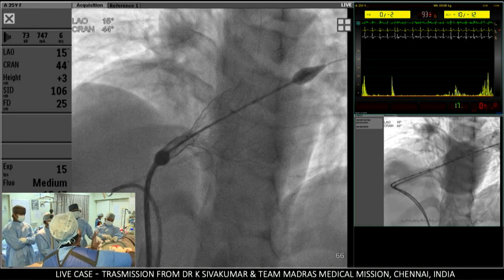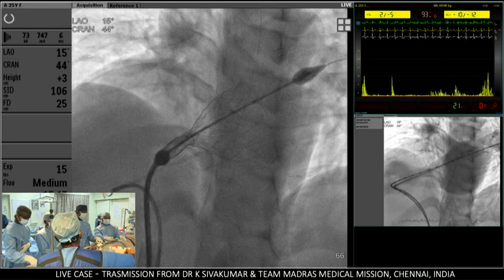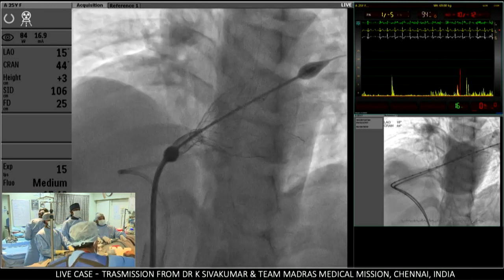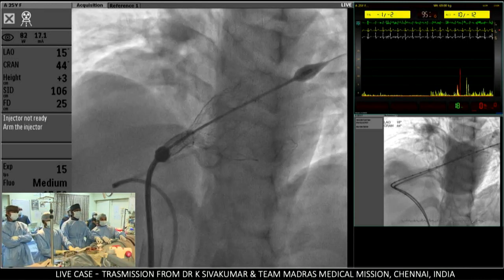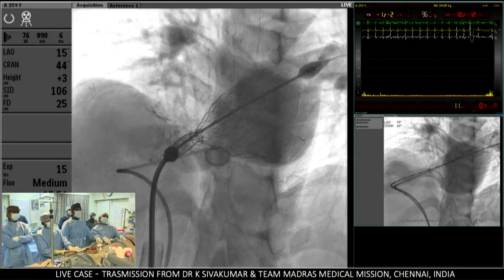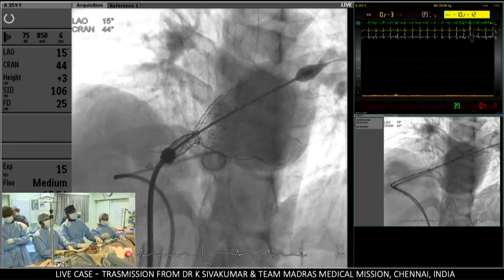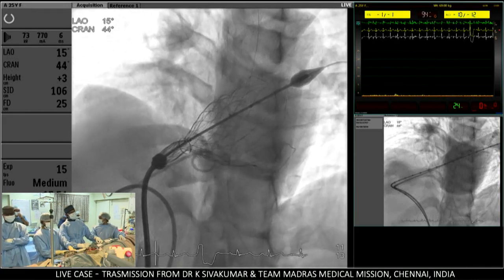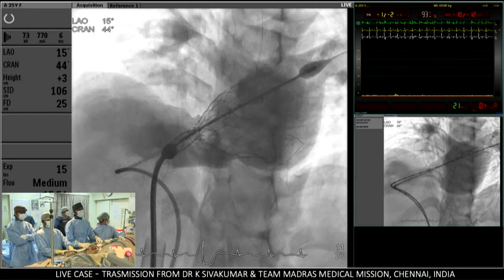Yep. Set 25 at 18. 25 ml at 18 rate. Ready? What do you say, Varakan? I think you cannot pull back more, because it's catching the waist now. And the blood pressure perhaps may be a little bit compromised. Blood pressure is stable right now.